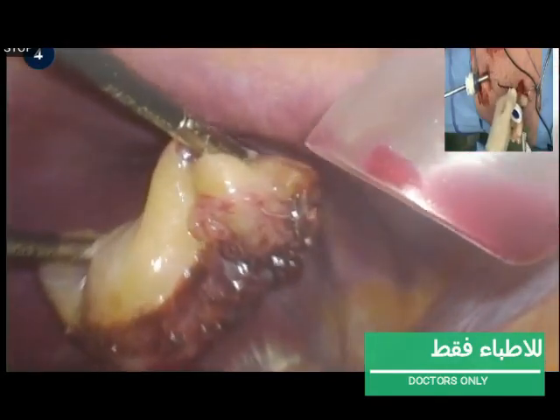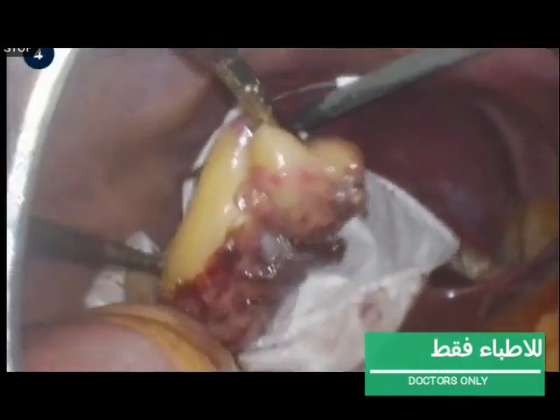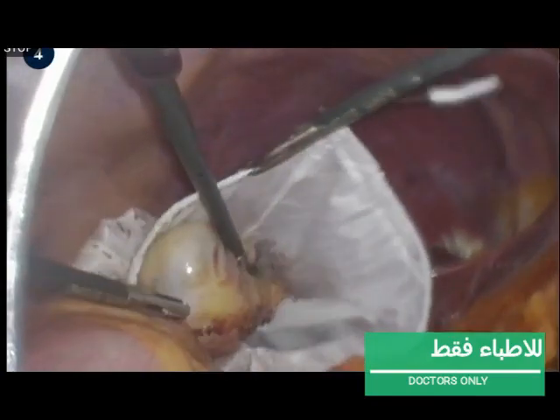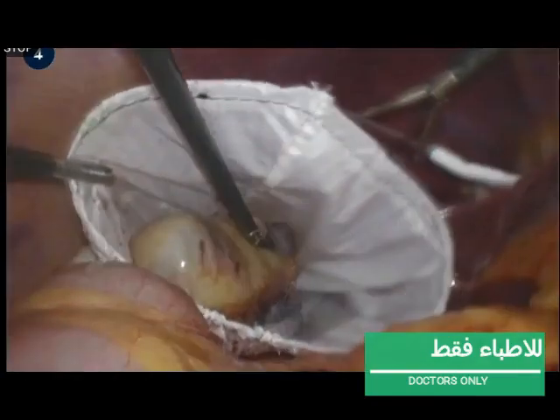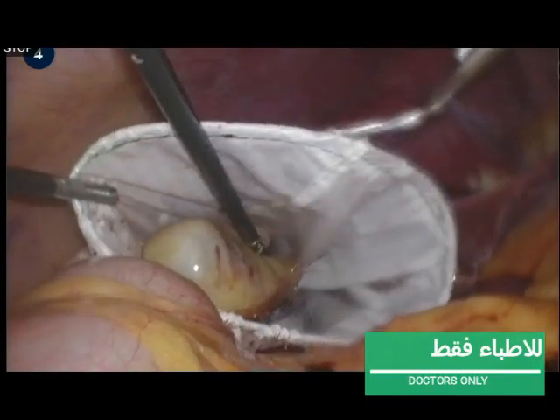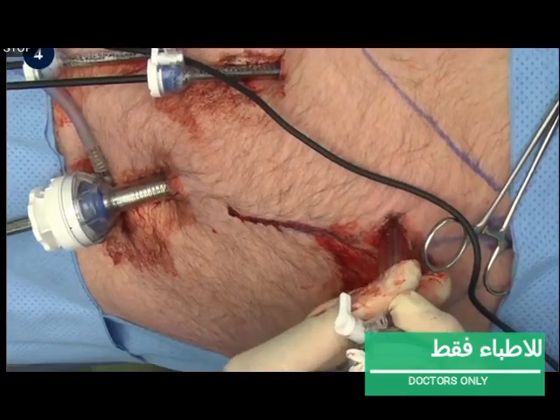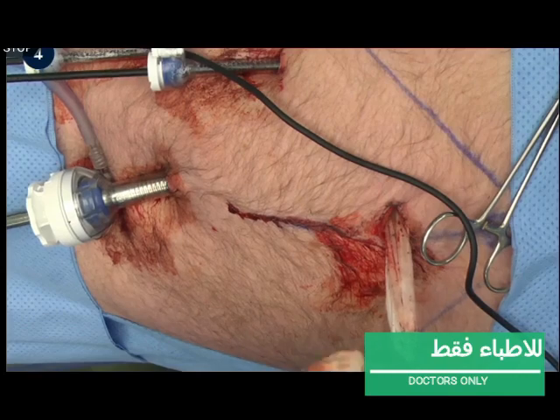An endo-bag is inserted and the gallbladder is placed inside the bag. Irrigate the abdominal cavity in case of gallbladder perforation that has caused a leakage of bile. The endo-bag containing the gallbladder is then removed from the abdominal cavity through a trocar portal.